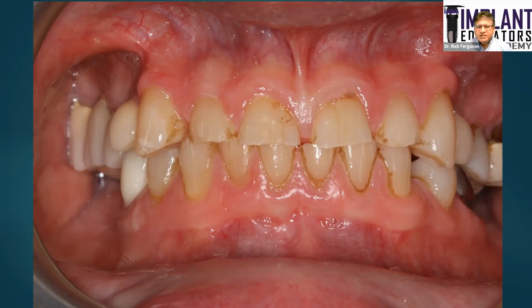So typically for a case like this in the past, what I would do is have the lab do a traditional wax up, get them some stone models, and they will open the vertical and take wax and wax in all the teeth. And that was a very expensive proposition for us because it would cost probably $600 to $900 for the lab to do such a wax up. So today, what we do is we do it digitally, of course.